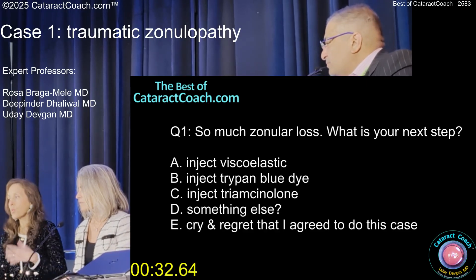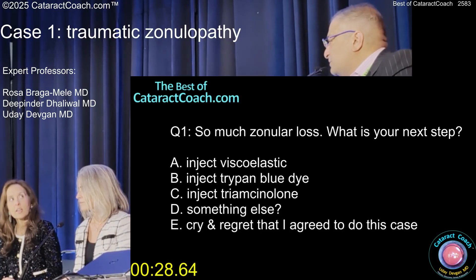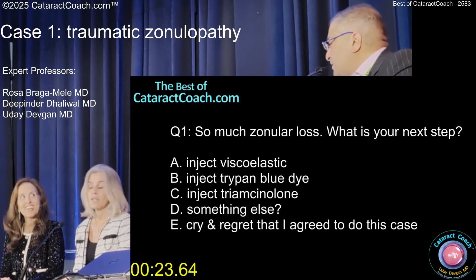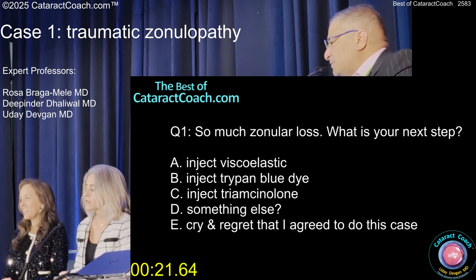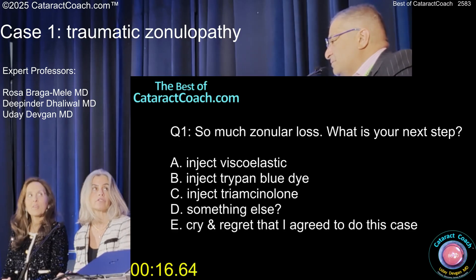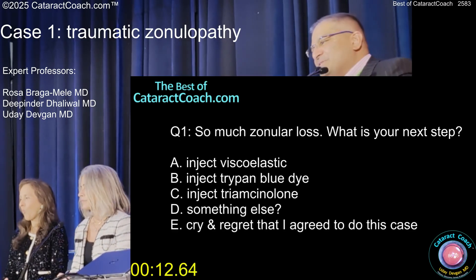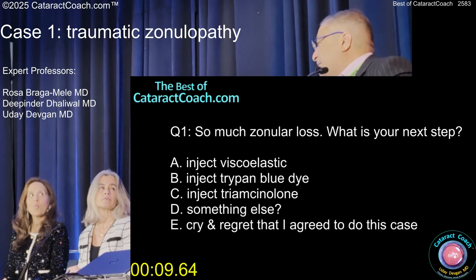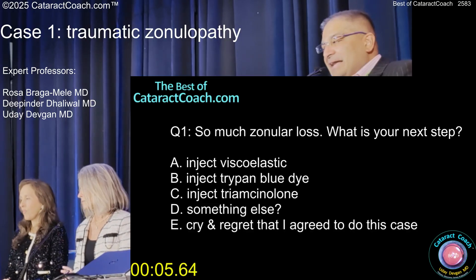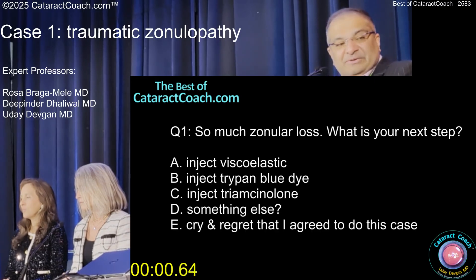If you're really concerned about vitreous loss, you can inject triamcinolone. How do you know there's no vitreous? Then you should inject triamcinolone — put triamcinolone first. What would you do, Rosa? Yeah, I'd probably put a bit of triamcinolone in and see what was going on, and then I would inject viscoelastic over that area for sure. I like the triamcinolone idea a lot because I can't tell if there's vitreous. So I think putting a little triamcinolone is going to make it a lot easier to see. And if you put viscoelastic, it's hard to just restain after with the triamcinolone.